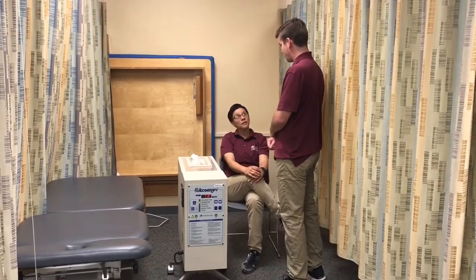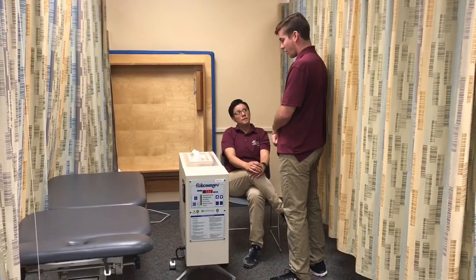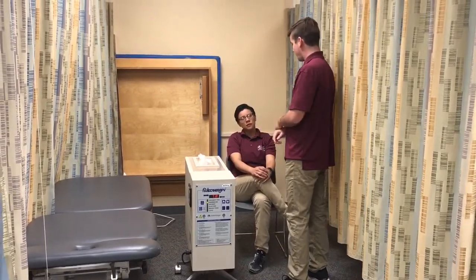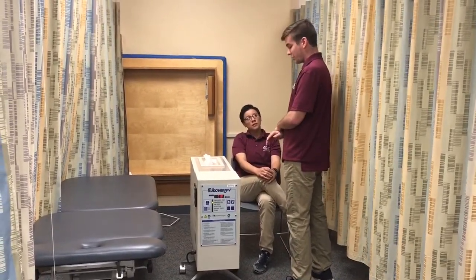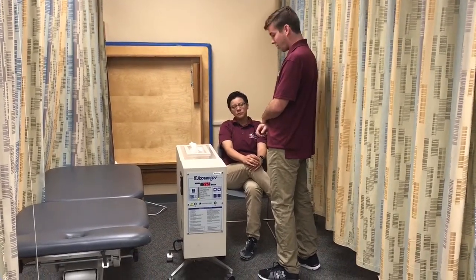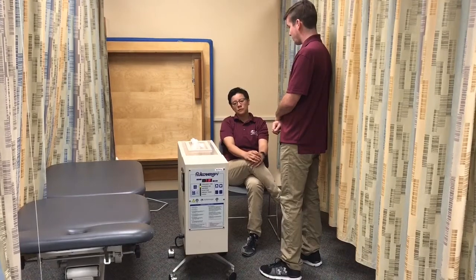I saw on your chart that you're experiencing some pain in your right hand. So today we're going to be using the fluidotherapy machine, which uses a mixture of warm air and the medium to help create a constant temperature. This will help increase your range of motion, increase your blood flow, and hopefully decrease the pain you're having.